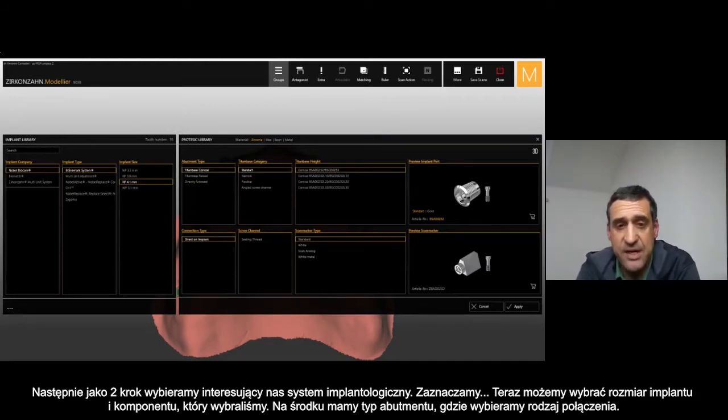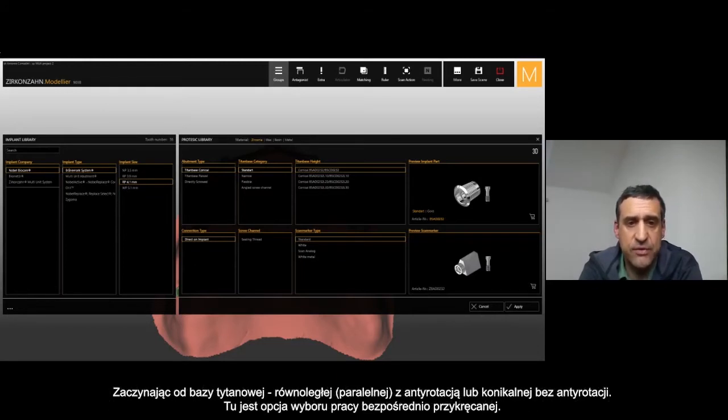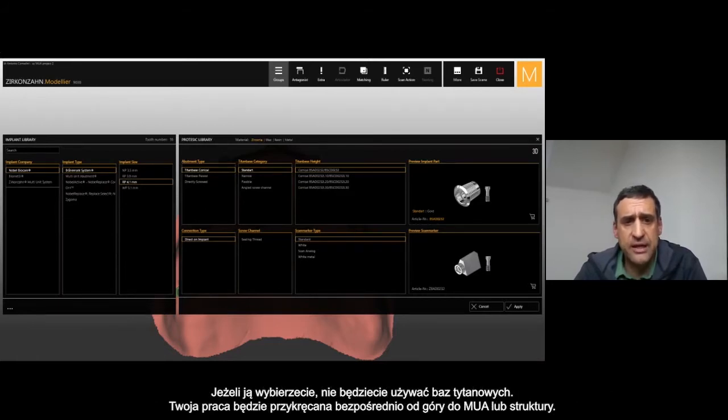In the center, we have the abutment type — you can choose different connections. Starting from titanium base conical or titanium base parallel — parallel with anti-rotational or no rotational for the conical. Then you have the choice to select directly screw, meaning you don't want to use any T-base but you want to screw directly on top of the bar or the multi-unit or directly on the framework without any connection.